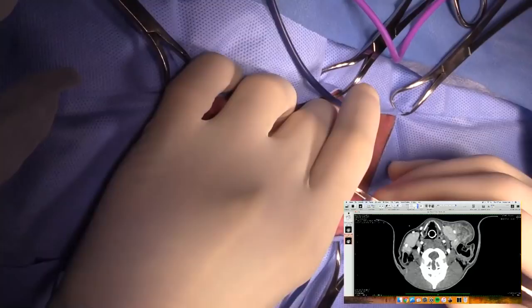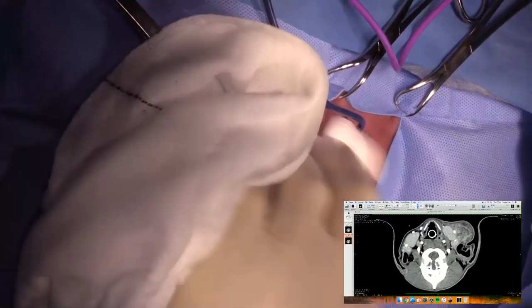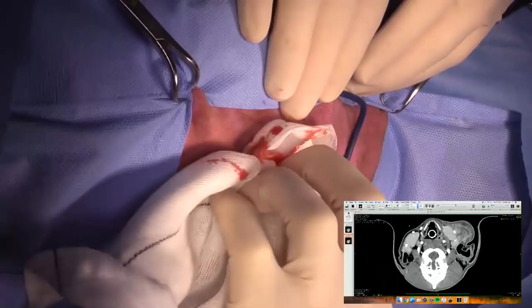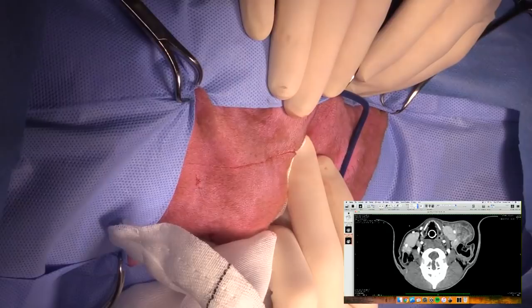So making an elliptical incision. Can you provide some retraction for me here? This is the wing of the atlas. I can palpate underneath my fingers here. We're getting a little bit light, so we'll just have to give some fentanyl or Alfaxan. You see a bit of twitching here. And that kind of mottled appearance to the subcutis and subcuticular region is consistent with a foreign body or at least an abscess, where you have that edema that's going on in the skin.